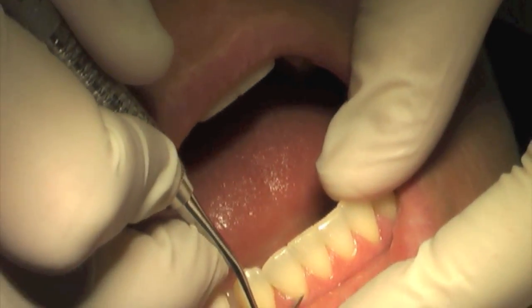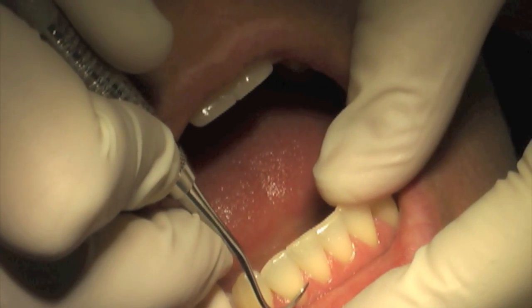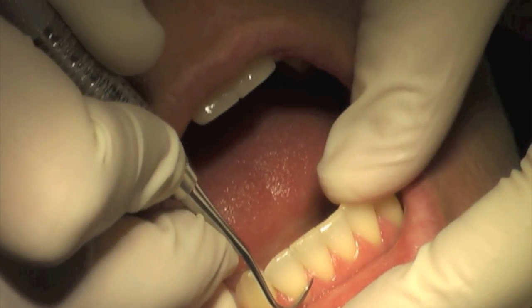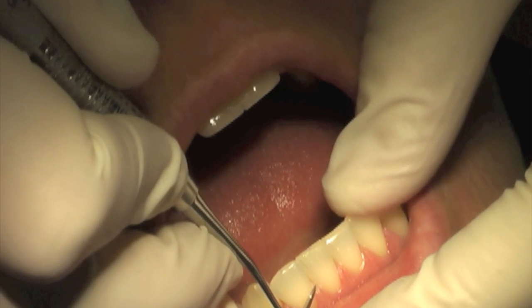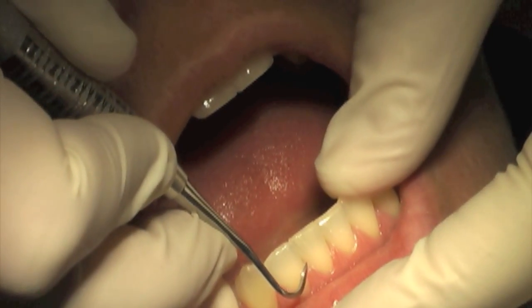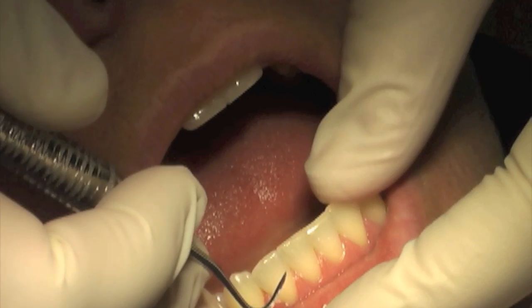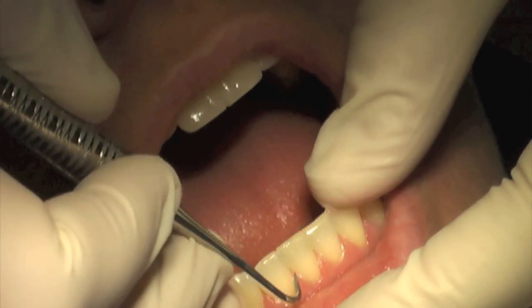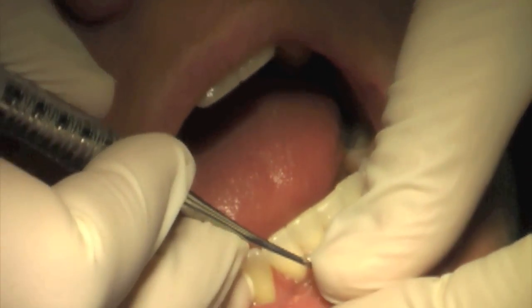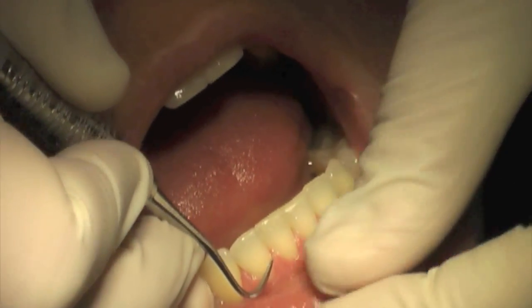But if you start here and then you don't turn, pretty soon I'm out here in her gingiva. And if I turn slowly, look at that — if I were subgingival, I would just be digging into her gum. So that's the difference between adaptation — staying in close, close, close contact — and non-adaptation.